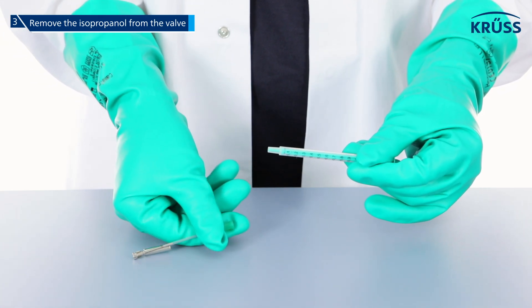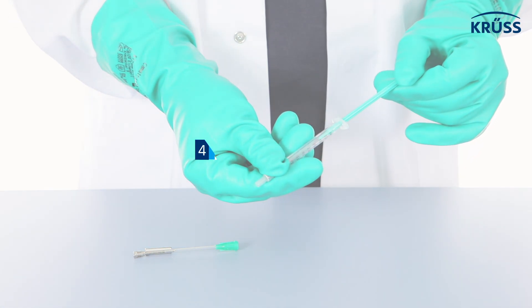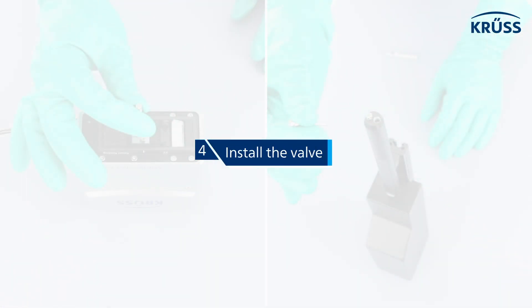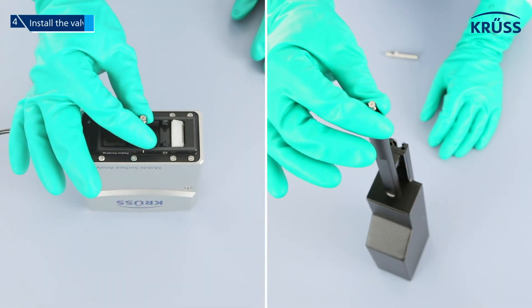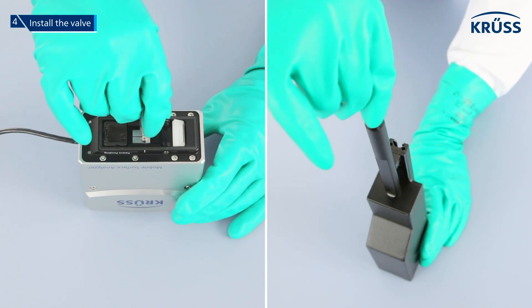Always remove the plastic needle and valve before pulling air into the syringe. Step 4: install the valve. Screw the cleaned valve hand tight into the instrument using the valve wrench.